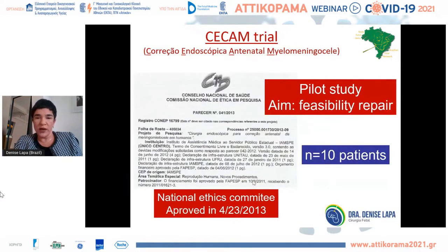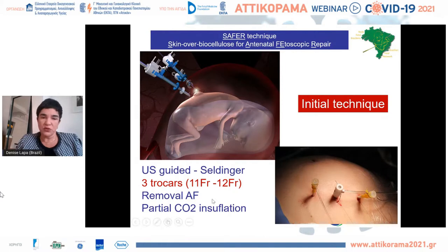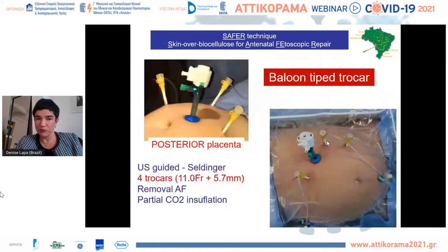So we went on with a pilot study that I had the opportunity to present in Nice in 2014, and I was crushed by all the American guys that exist on Earth, but I kept going. At that stage, we were using three trocars, and we removed the amniotic fluid and injected the CO2. When we started, we used gas for anesthesia, but now after our case 33, we only use intravenous anesthesia, which is also going to prove better in the future. We then moved to four trocars.